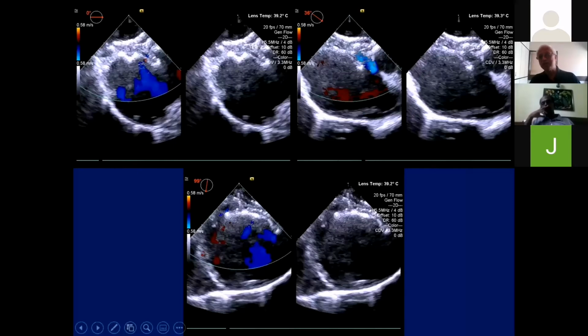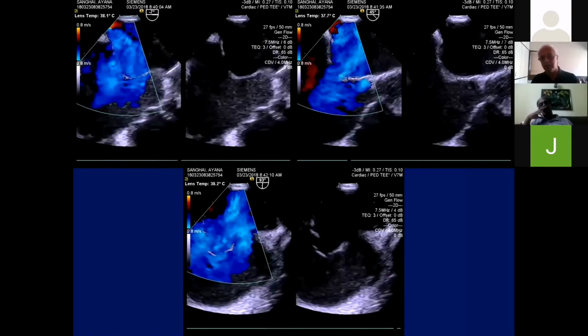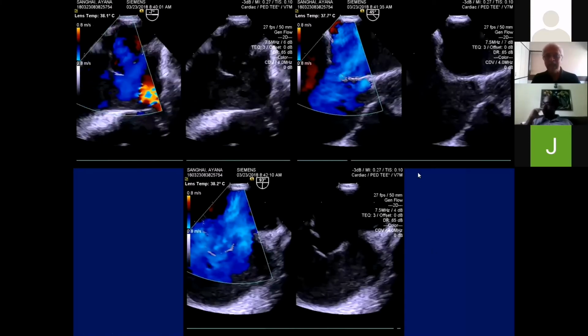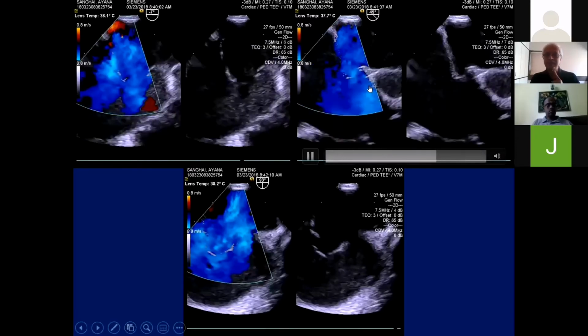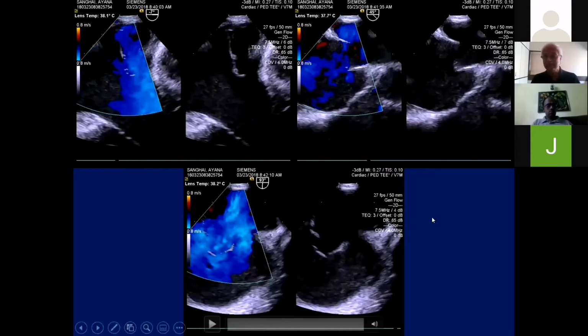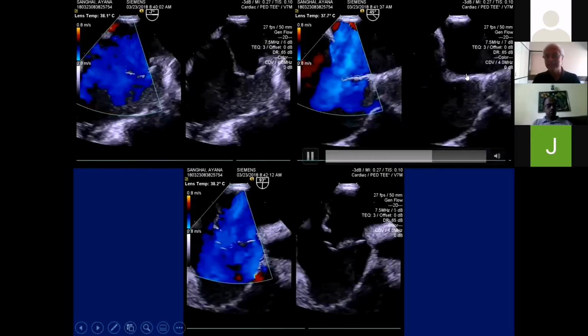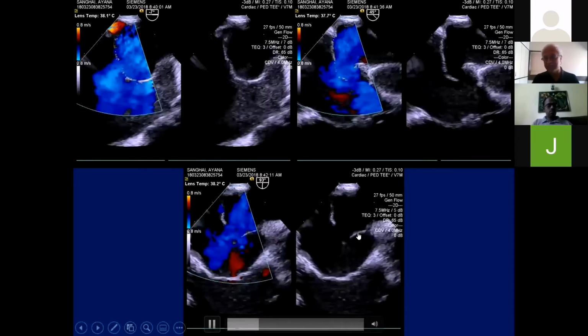This is a huge aneurysm. You see 90% of the septum is formed by septum primum. And there is a very tiny septum secundum right at the top here. Now in this case, if you see, as against the last case, the major defect is located anteriorly and is located superiorly. You can see here.